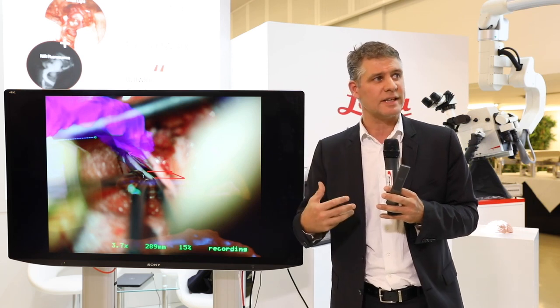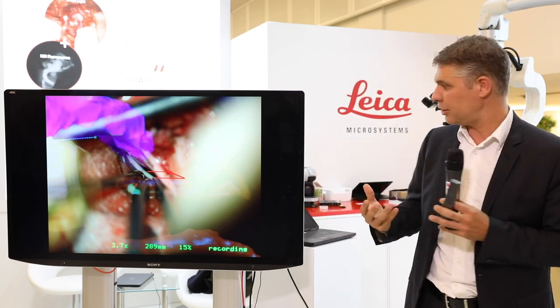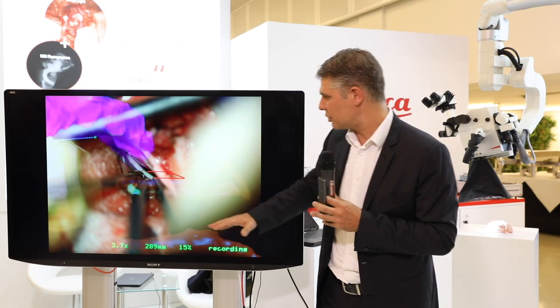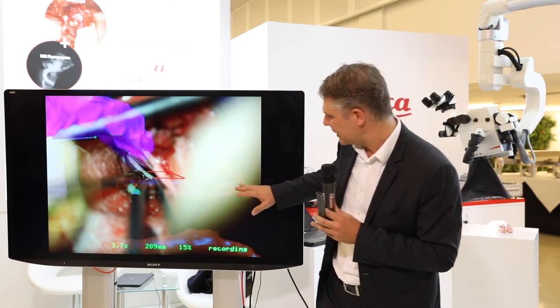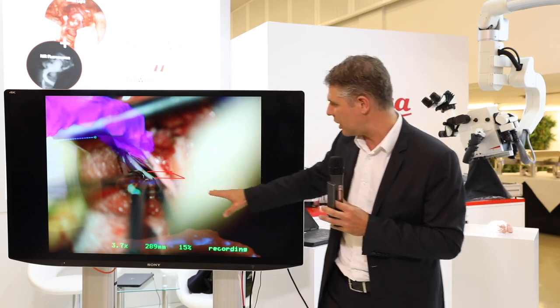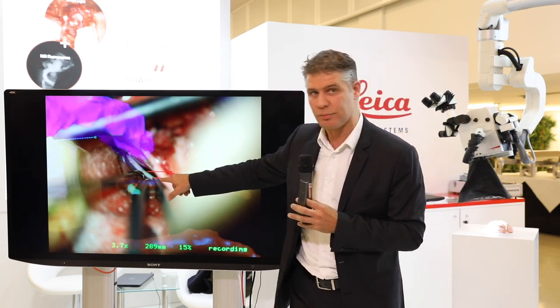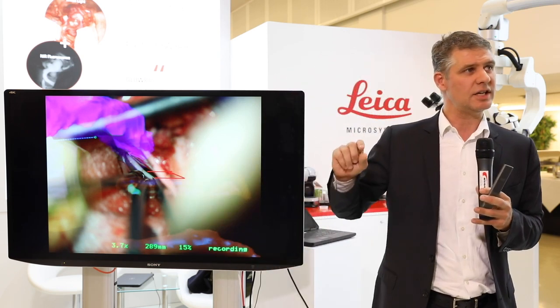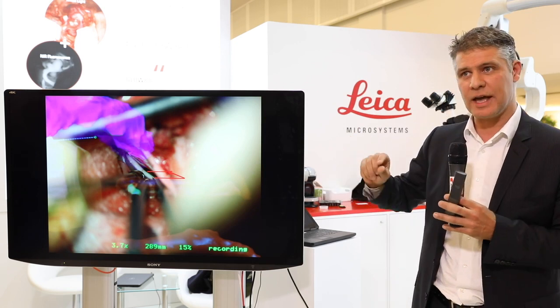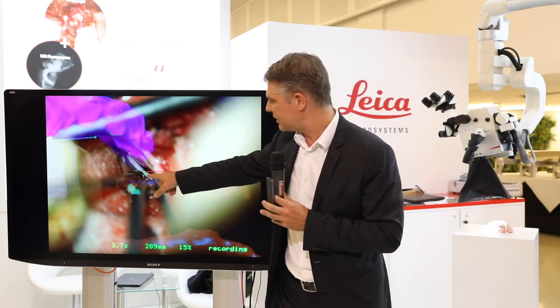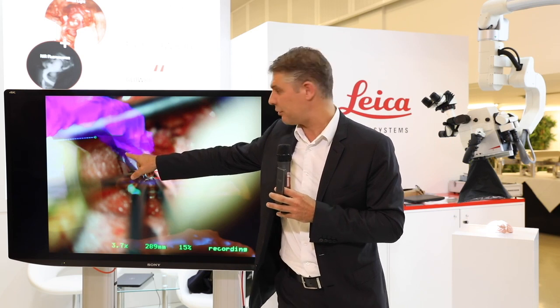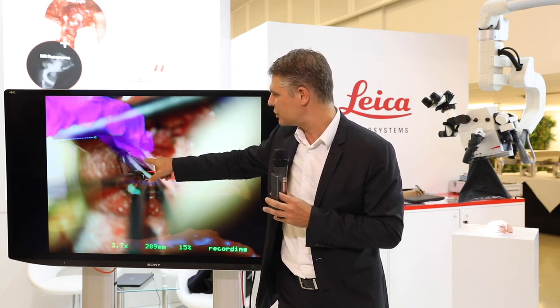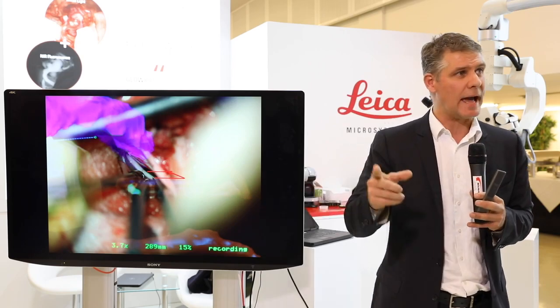When you move and drain CSF, you have brain shift, and everything starts shifting. There is here a faint image of the vertebral artery and the real vertebral artery — you can see them and readjust again toward the vertebral artery. You can see the 11th nerve going into the jugular foramen. You shift the overlay back to the correct position and then you are locked again in a very precise location.